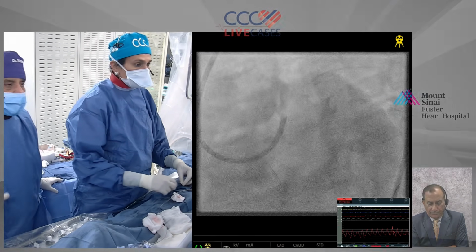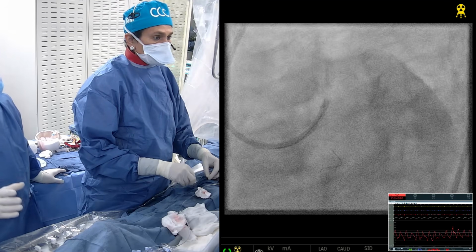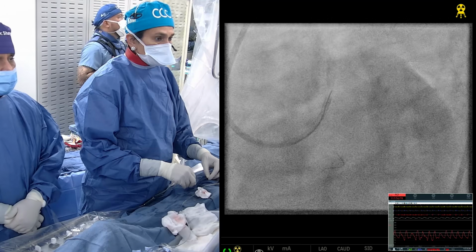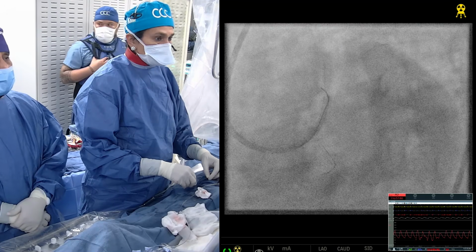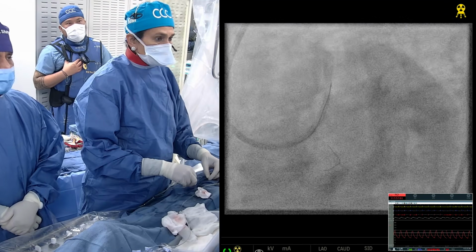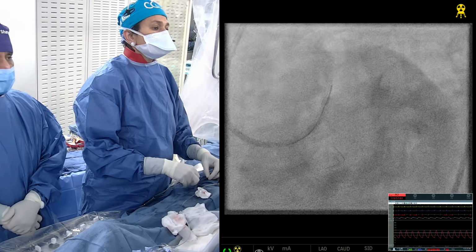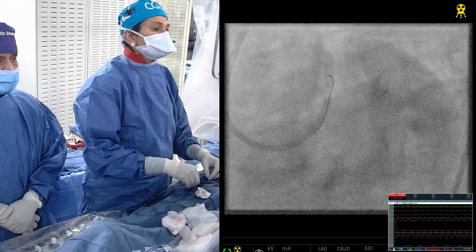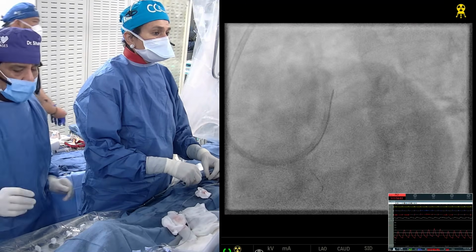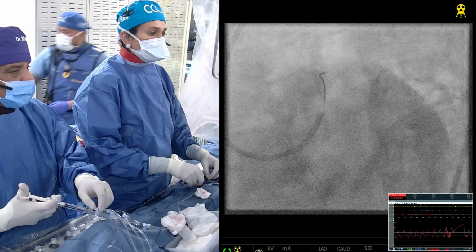So the question here is that by changing the direction of the wire, you may be able to do more ablation, kind of becoming a little orbital atherectomy rather than just rotational. In a short lesion, I think it's probably less important, but from time to time we do pull back the wire. The idea is that you are changing the direction of the rotor burr, and with the wire bias, you're trying to ablate different areas. But in the longer lesion, yes; the short lesion is very straightforward.